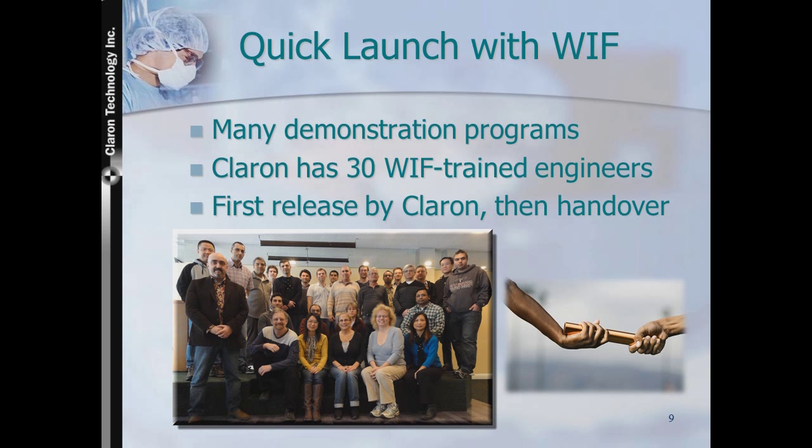The demo programs show, for example, how to create and customize a powerful user interface, or how to segment and visualize specific anatomical regions in a large image volume. We also offer to quickly develop or help develop the first release of the product, further cutting time to market.